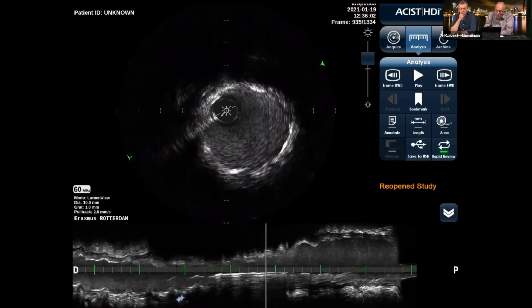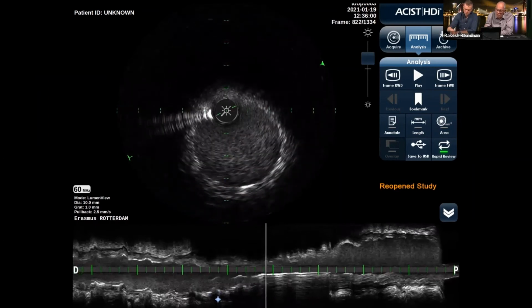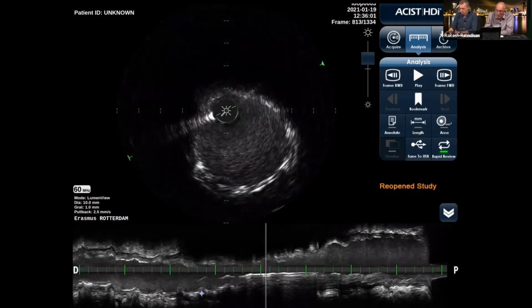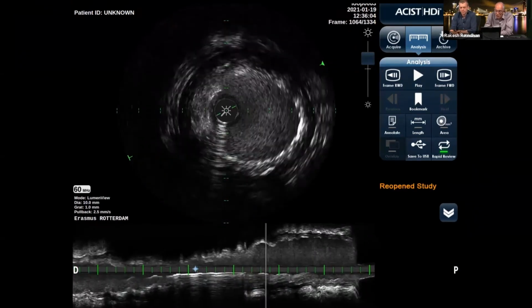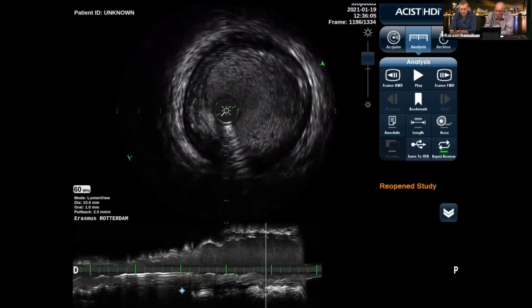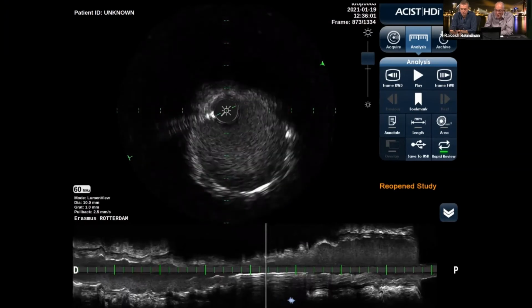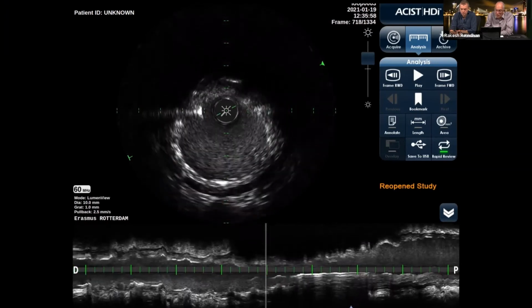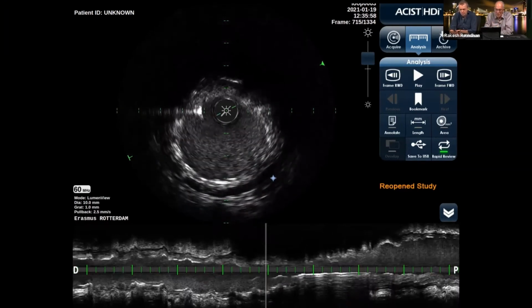And normally, well, what we said, you can try to push the thrombus back. The reason is that there is no room for the thrombus, but there is also another spot in there, and that we will demonstrate after we show you the final result on angiogram. So far, so good. Less thrombus, there is perfusion, there is a larger lumen in the stent. So everyone seemed to be happy. So this is the last result after that. We didn't measure, but the minimal stent area went from 8.1 to 9.3.